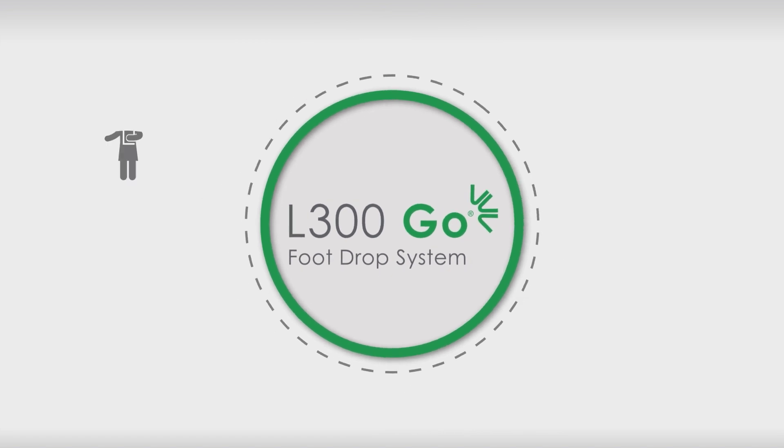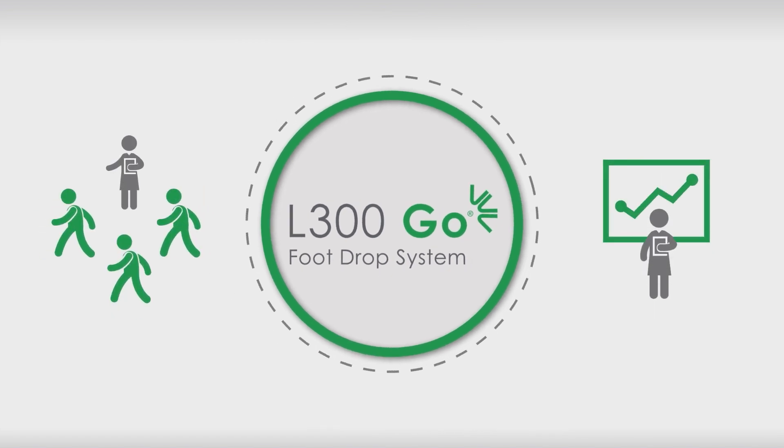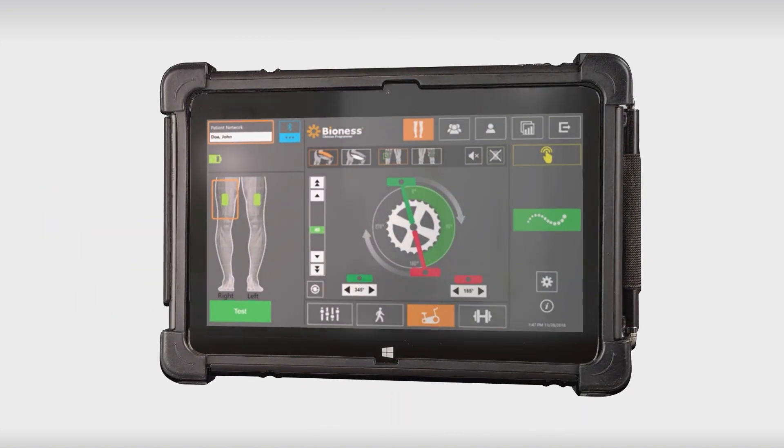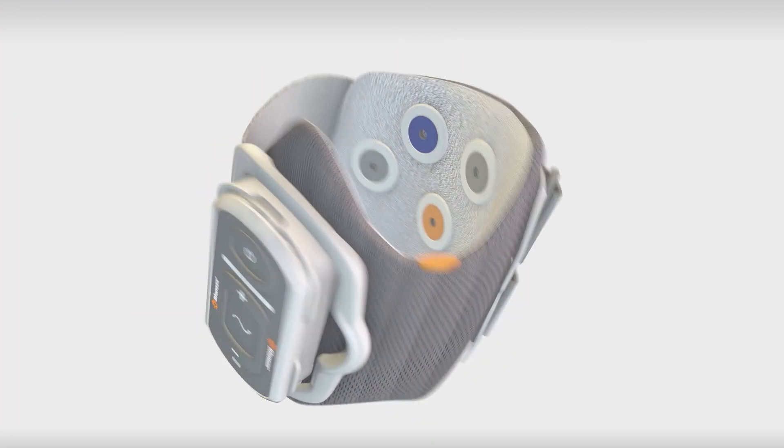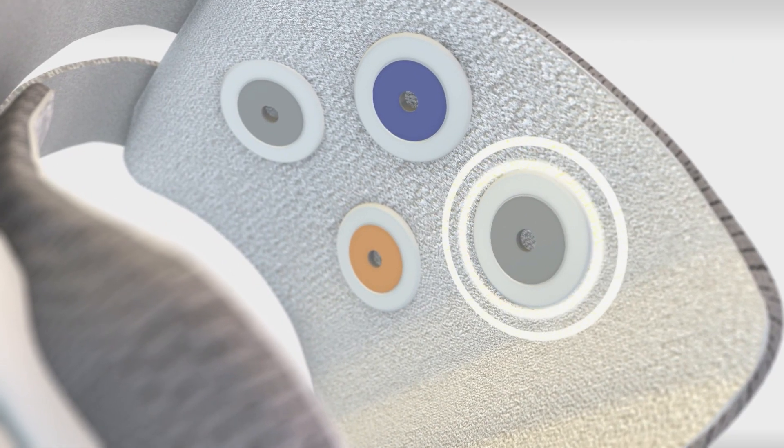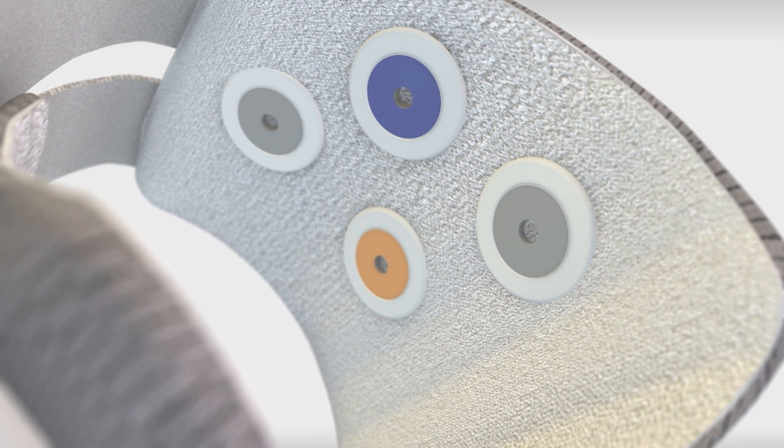L300GO is designed to combine clinical effectiveness with ease of use. Programming and setup are straightforward, with stimulation parameters preset based on user need. Multi-channel stimulation allows for separate adjustments for medial and lateral intensity, providing precise control over inversion and eversion.